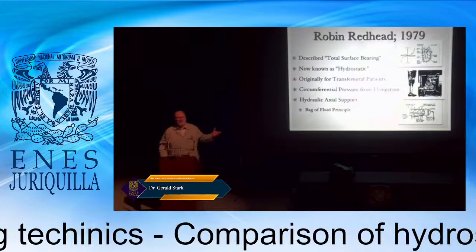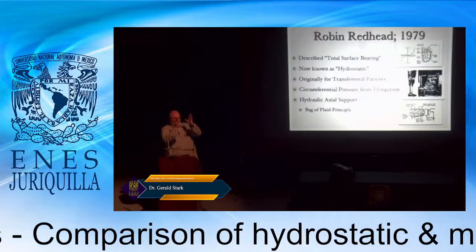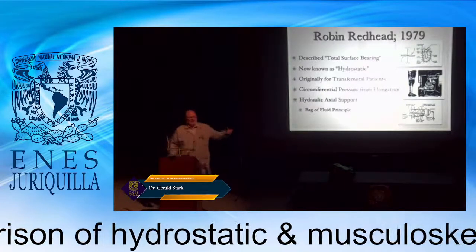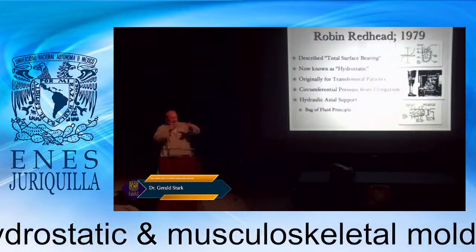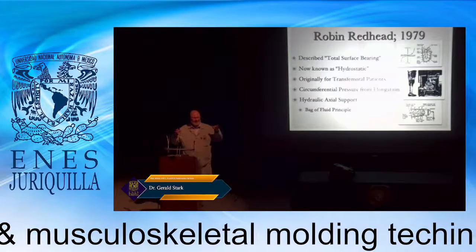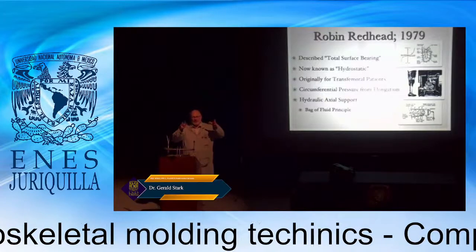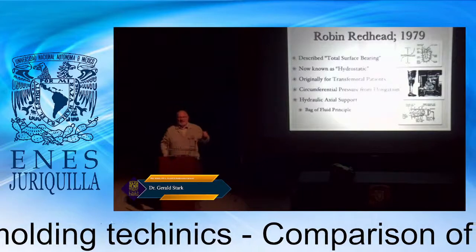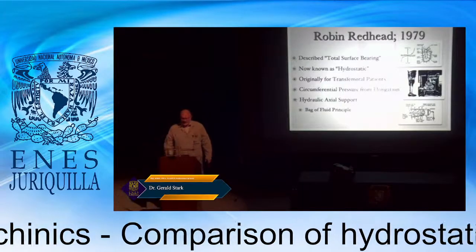Now, elongation is really important not only for transfemoral, when you draw the tissue away from the proximal brim and elongate the limb, you also do that for transtibial as well. And this creates a loading transversely. The limb is much like a hydraulic bag of fluid. If you can load it equally, and this is the key, if you can load it equally all the way around it, you can create a semi-solid that can support weight. And that's where subischial limb fitting comes from.